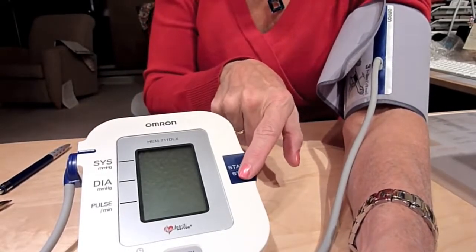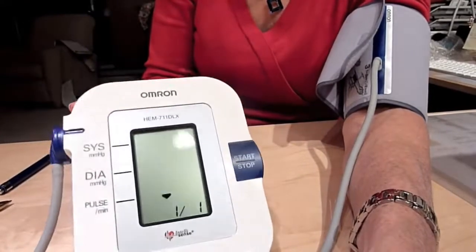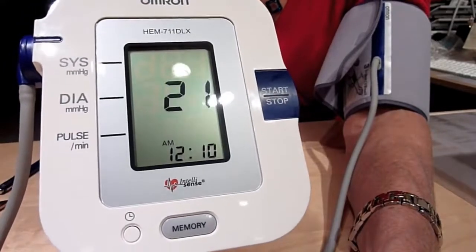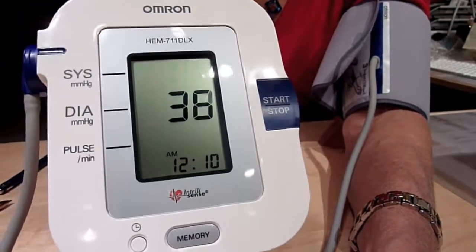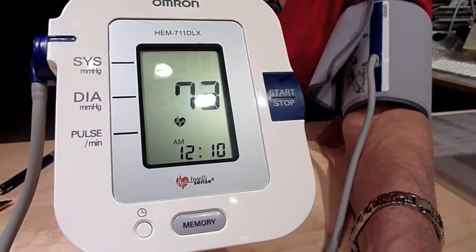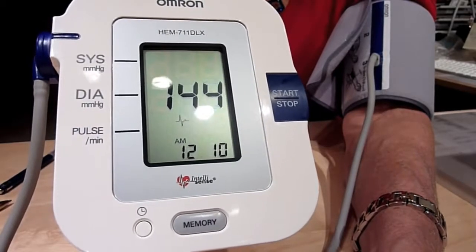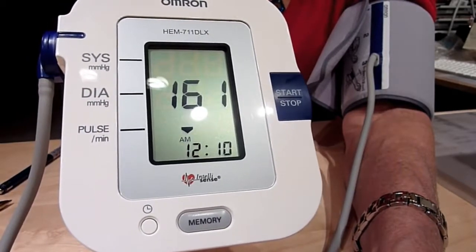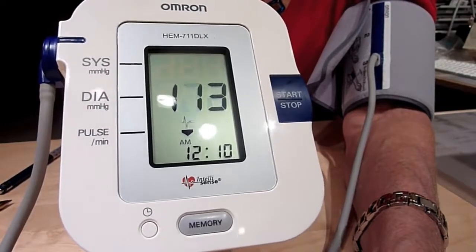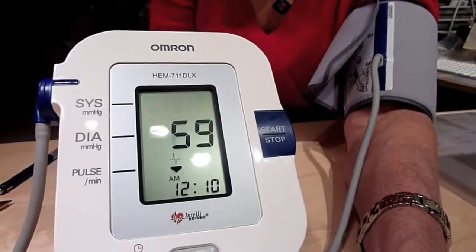All you do is hit the start button. You'll see the cuff inflate, and it'll take your blood pressure and your pulse. It's very quick with this unit — probably less than 15 seconds. You can hear it inflating, then deflating, and soon you'll have your reading.